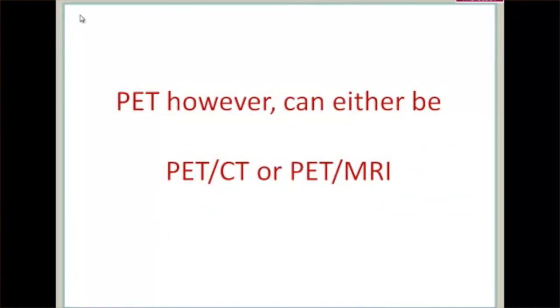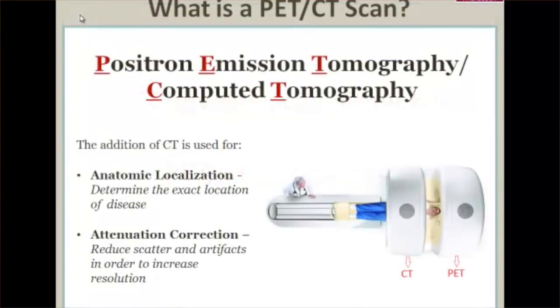One of the other important things to think about with this is there's two different ways to get a PET scan. So we said, okay, you can have a PET scan, and there's two different things that we can inject in you to get those images. In addition, though, there's two different ways to get a PET scan. It's either a PET CT or a PET MRI. And I imagine that a lot of people who've gone through these steps are certainly aware of PET CT, but you may not be as aware of PET MRI. It's fairly new in the US.